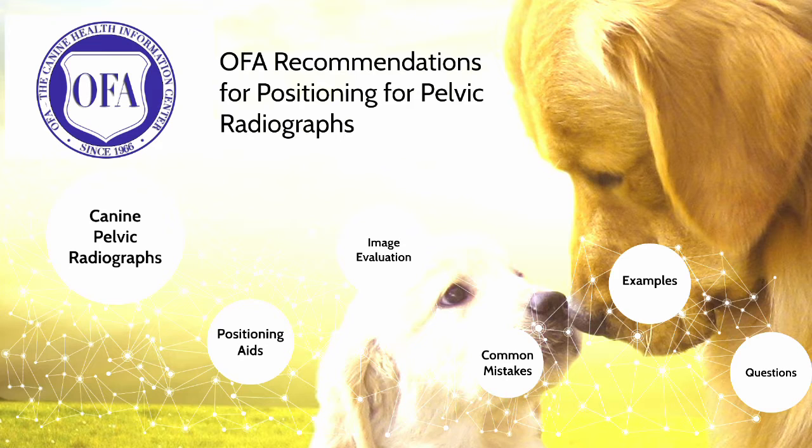The OFA is a nonprofit organization that serves as a databank and health information center with the long-term goal of reducing genetic diseases. Today I will be speaking on behalf of the OFA by going through proper positioning techniques and guidelines for obtaining pelvic radiographs for hip dysplasia evaluation. As a disclaimer, there are no conflicts of interest in giving this webinar.